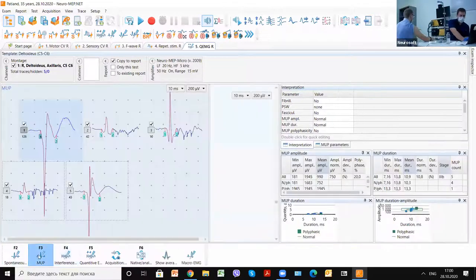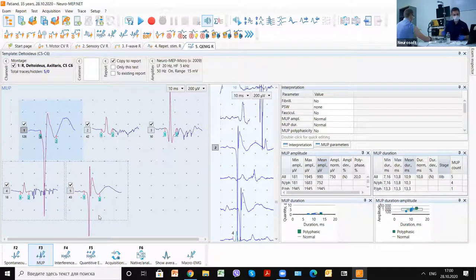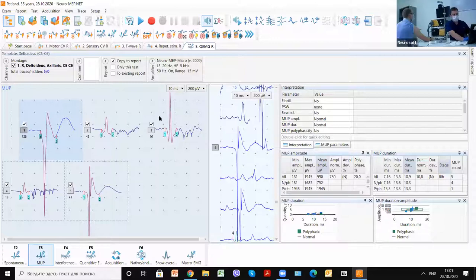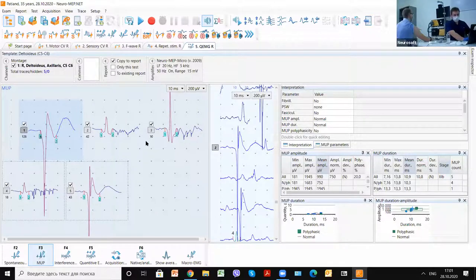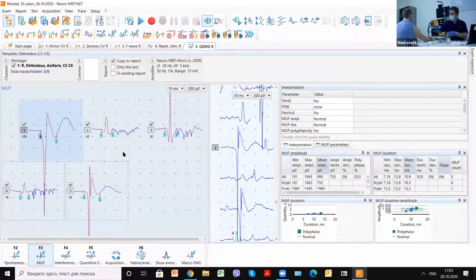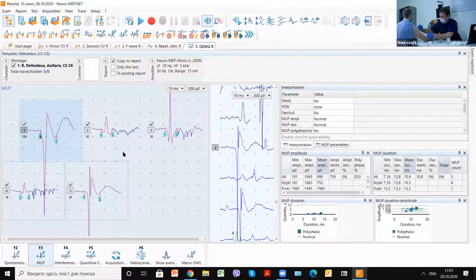And after that, we can change, for example, now we need to get up to 20. So we can change the last position.